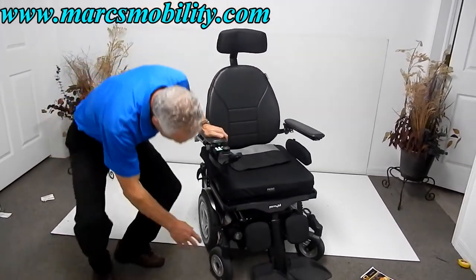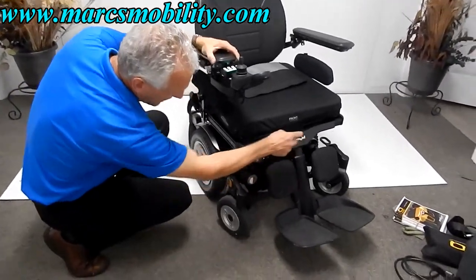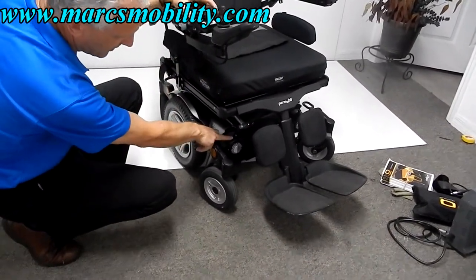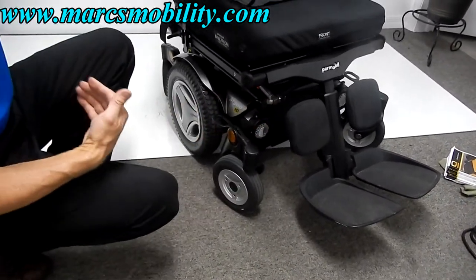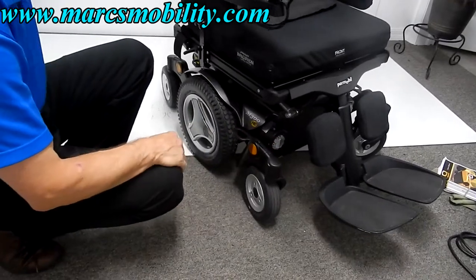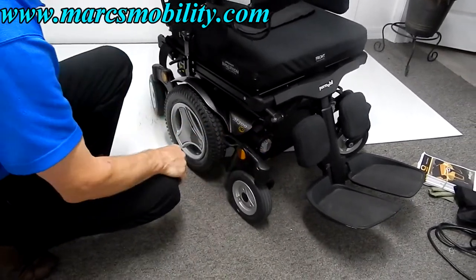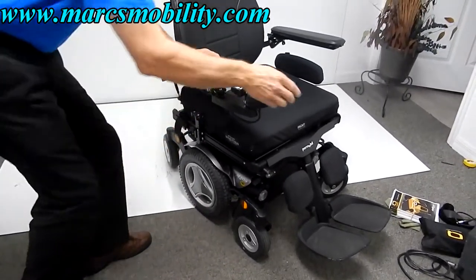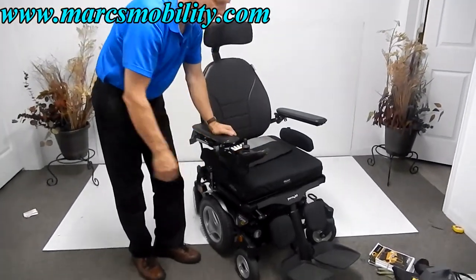On the front of the chair, you've got your motor sticking out — the right motor here and the left motor on the opposite side. If you need to put this chair in neutral, there's a lever on top of the motor. Pull the lever towards you on both sides and you're in neutral — you can push the chair around. Push it back in and the chair is back in gear. When putting the chair in neutral, always turn the power off, because you'll have some resistance with the power on in neutral.